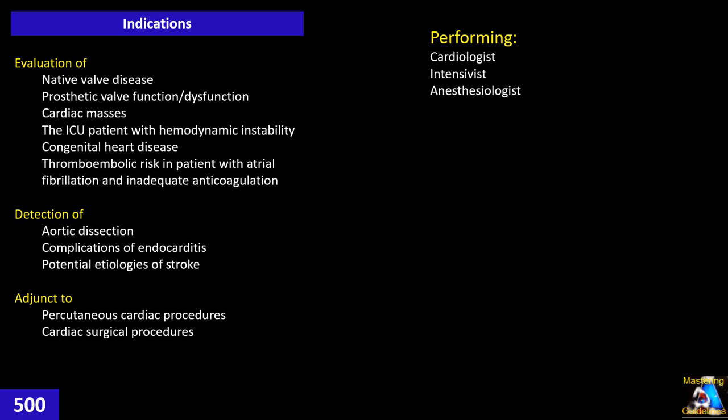Indications for the TEE: as a general rule, whenever TTE is not conclusive, we go for the TEE. Otherwise, as a general rule again, we should always do TTE before the TEE. I have seen a lot of cases where patients had pathology that was missed in the TEE, but it was very obvious in transthoracic echocardiography. So whoever is indicated for the TEE, the patient should first have a TTE.